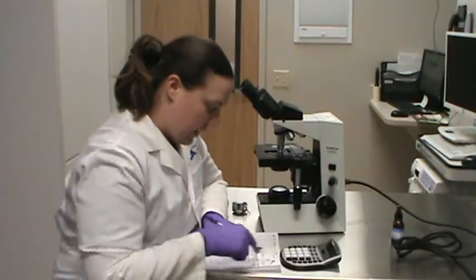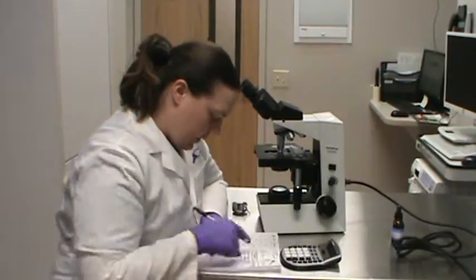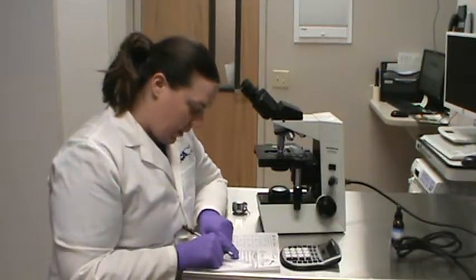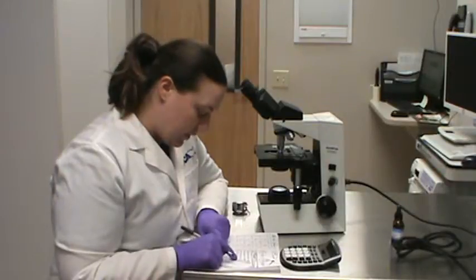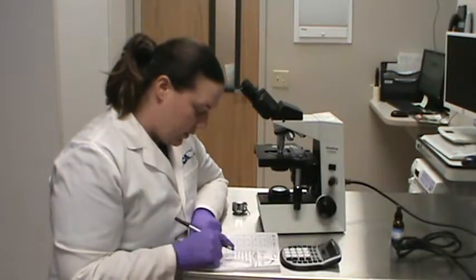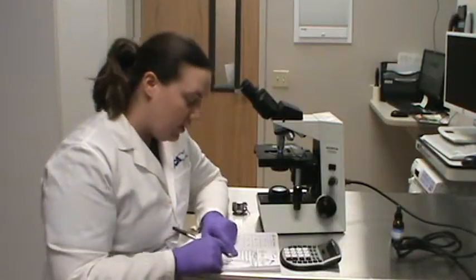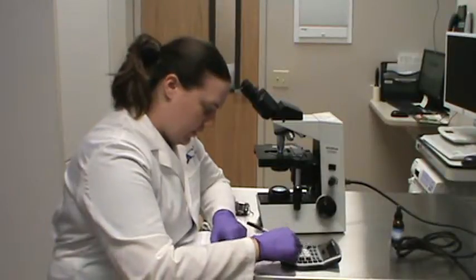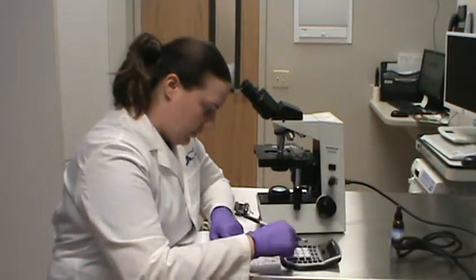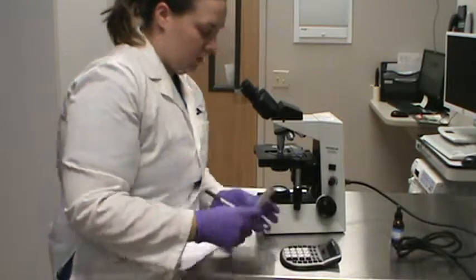Lymphocytes, I counted 5, so that's 5%. Monocytes, I counted 3, so that's 3%. Basophils, I counted 2, so that's 2%. And eosinophils, I counted none. I did not see any, so that's 0%. So if you take all those and add them up, 85 plus 5 plus 5 plus 3 plus 2 is going to equal 100.